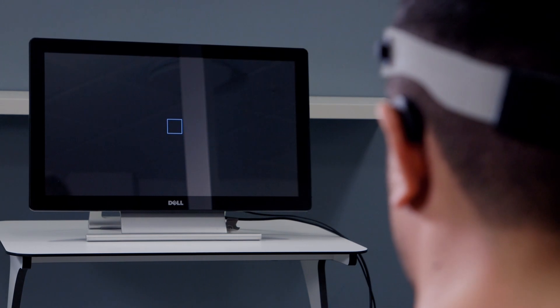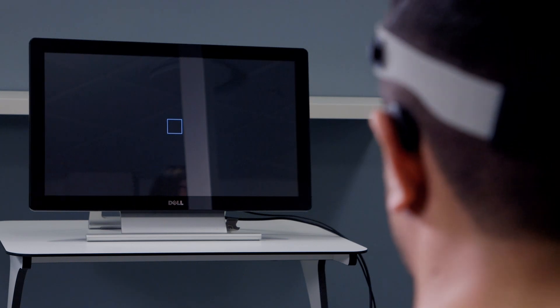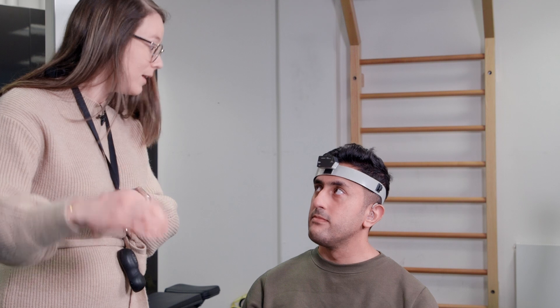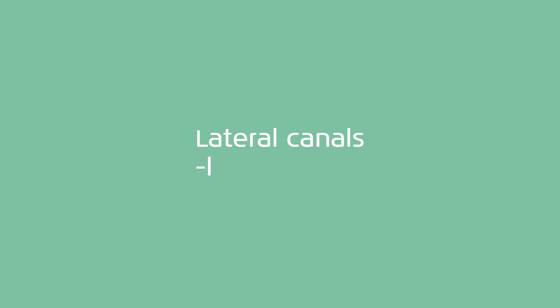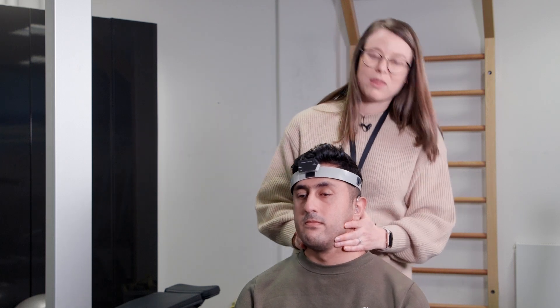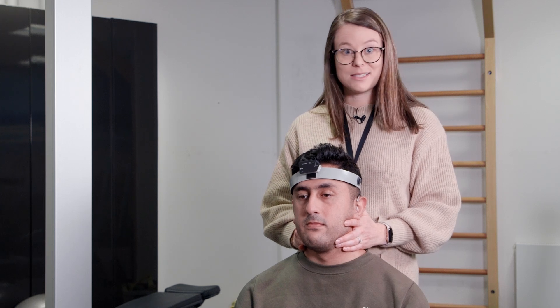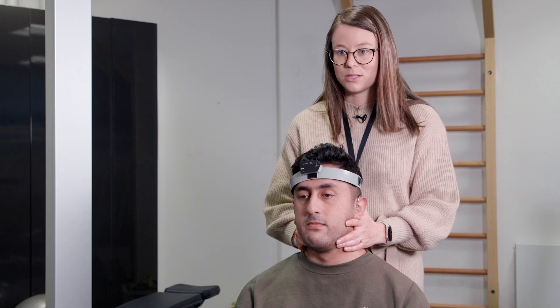You're going to see an optotype pop up on the screen, and I want you to tell me which direction the optotype is facing — left, up, down, or to the right. If you don't know the answer, you can say, I don't know. And I'm going to be moving his head. We're going to start with the lateral, which is left or right directions, because we're looking at the lateral semicircular canals.